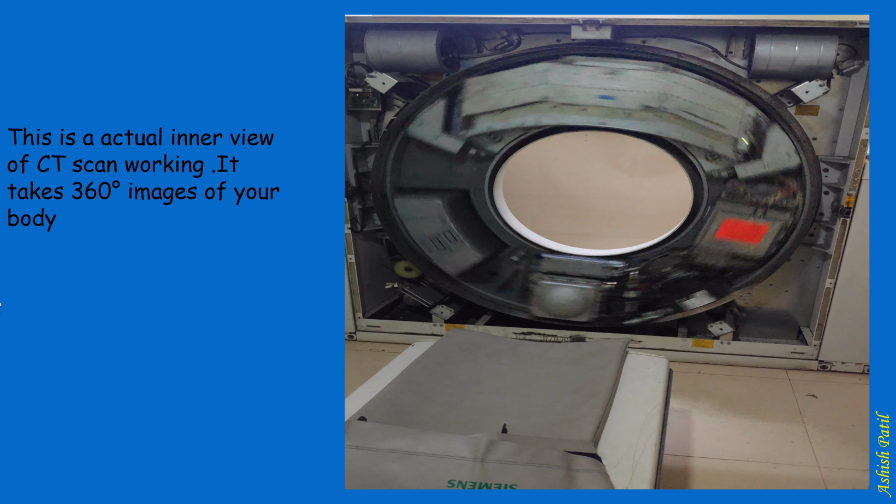This is an actual inner view of a CT scan working. It takes 360-degree images of your body.